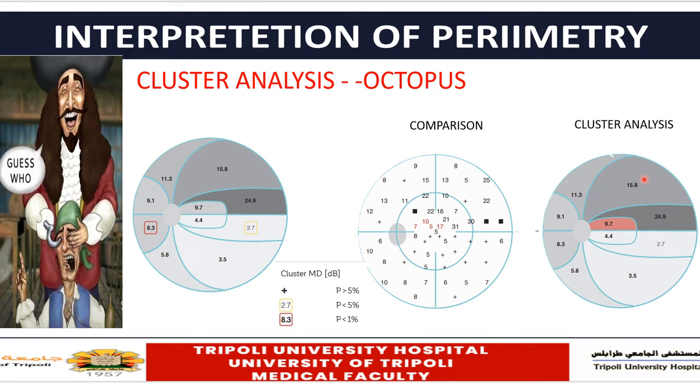So it is based on the principle that glaucoma will cause sectorial damage to the retinal nerve fibers, in particular clusters. So when they superimpose, for example, the G matrix of the octopus field with the RNFL map, they divide the retina into 10 clusters corresponding to the distribution of the nerve fibers that are more vulnerable to glaucoma.